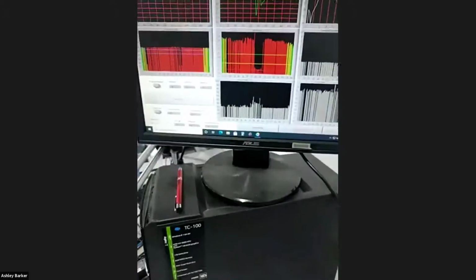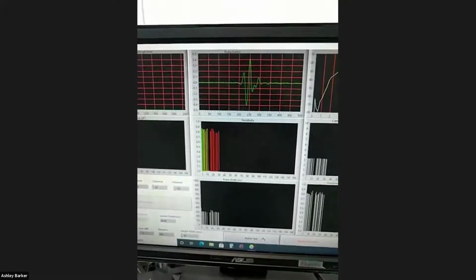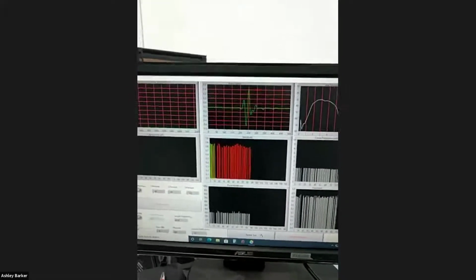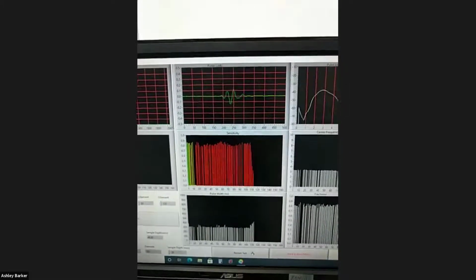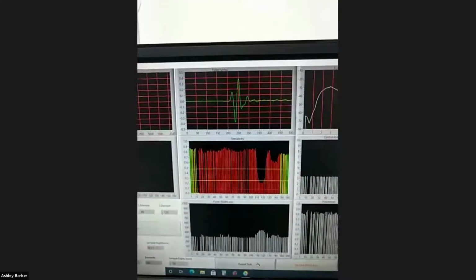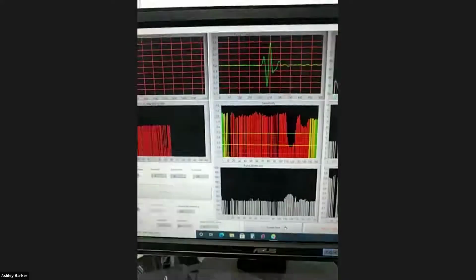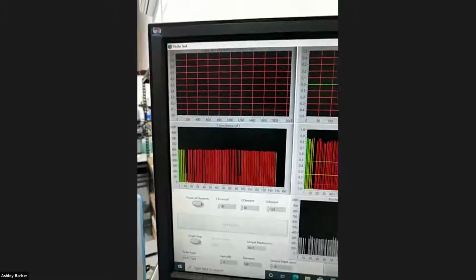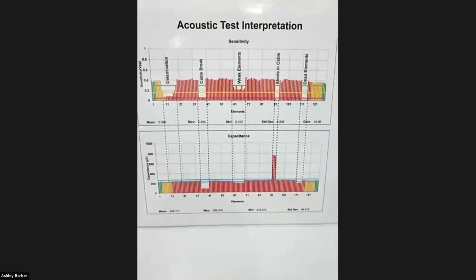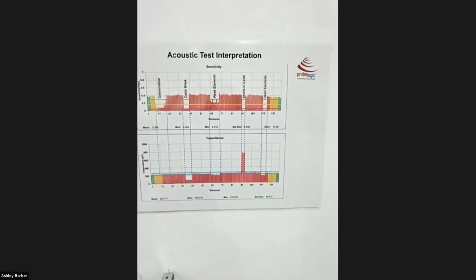It measures lots of parameters, but if we go measure there, you can see the sensitivity plot that's coming up. You can see this probe's got lots of problems, but we can straight away see what elements are performing and which ones aren't. You see this nice curve down backwards and forwards. That will either be a lens delamination just from the shape, or there's a bubble sitting on the probe face that I haven't cleared off properly. So it's quite nice for doing all sorts of diagnosis. And there's the capacitance of each element. Lining up the capacitance and sensitivity, this is probably hard to read, but we can do fault finding of what that fault is, whether one goes down and the other one does, or whether it's just one and not the other.